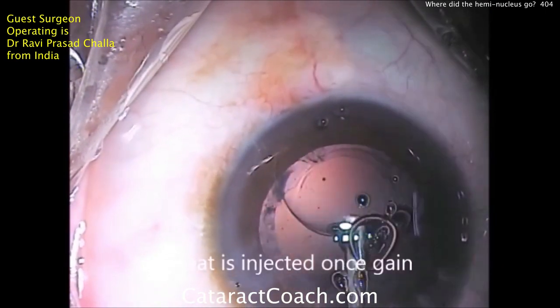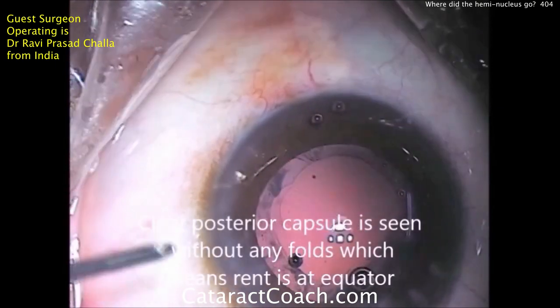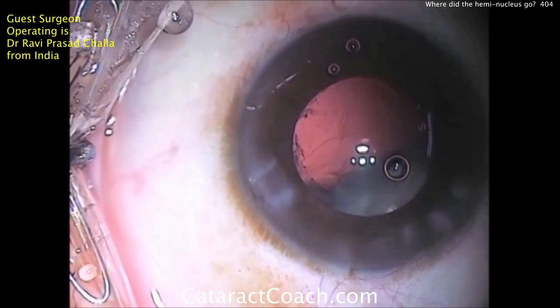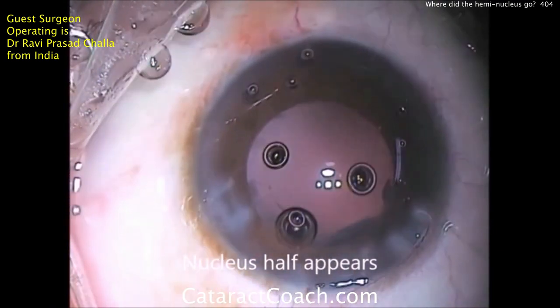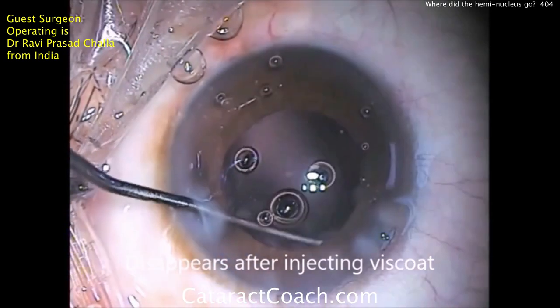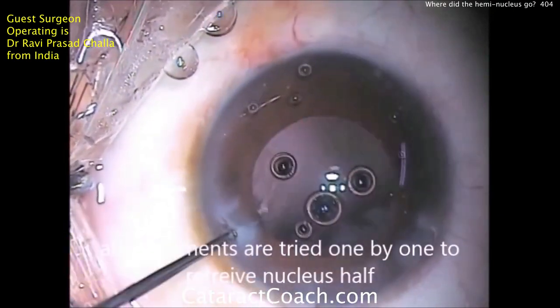So now only half the nucleus is gone — one heminucleus is gone and the second piece is still there, underneath the sub-incisional iris. As the anterior chamber depressurizes, that piece comes forward again. As you pressurize, it disappears. So we need to get that piece up. Under the iris goes this Sinski hook, and we're going to bring that piece centrally.